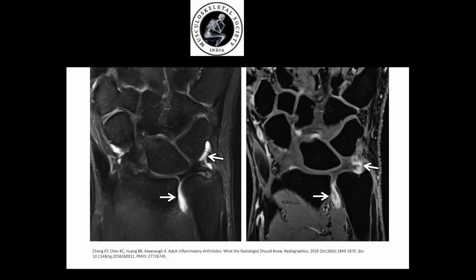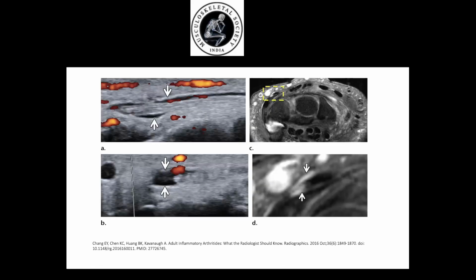So this is a classical example. There are no bone erosions, no soft tissue edema. So clinically the patient did not have active disease. But on MR, there is a small volume DRUJ effusion with synovitis, as evidenced by these frond-like projections. On post-contrast imaging, there is enhancement in keeping with active synovitis. There is also enhancement in the radiocarpal joint and in the midcarpal joint. So this patient went on to have more aggressive treatment than he would normally have had, which is a win of imaging over clinical assessment, I would say.